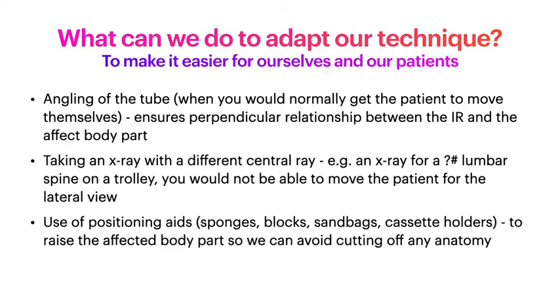But if you've got a patient from A&E and they're on a trolley with a query lumbar spine fracture, you are not going to move them at all. You're going to keep them as they are, and you're going to centre using the horizontal central ray against the wall bucky, because we don't want to injure them any further and make their injuries worse by moving them.